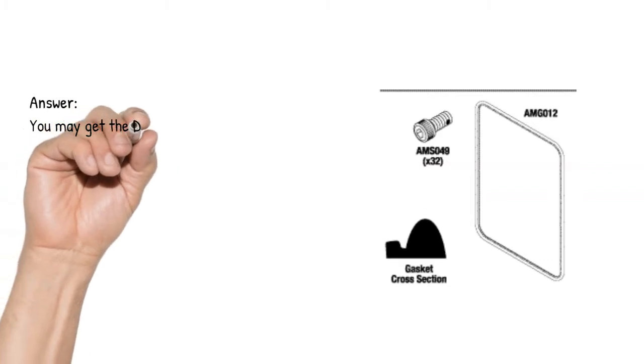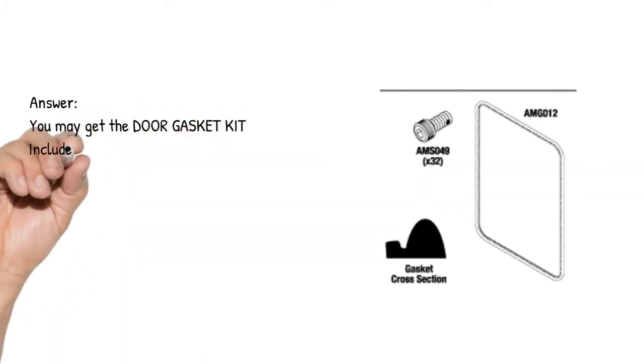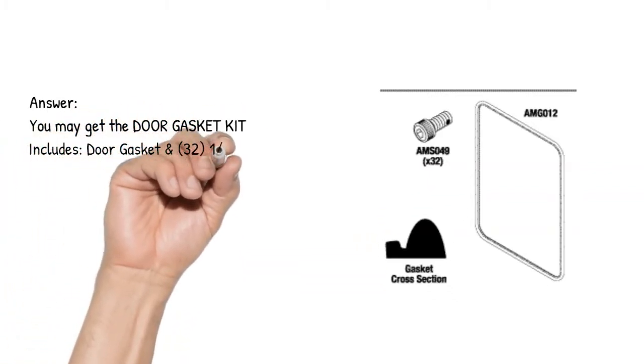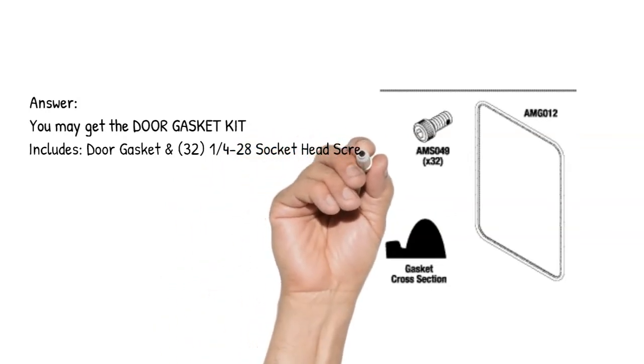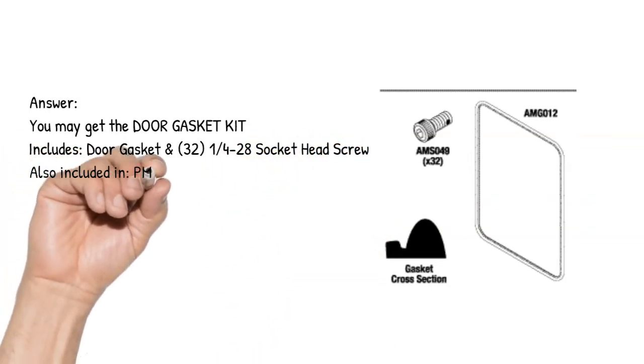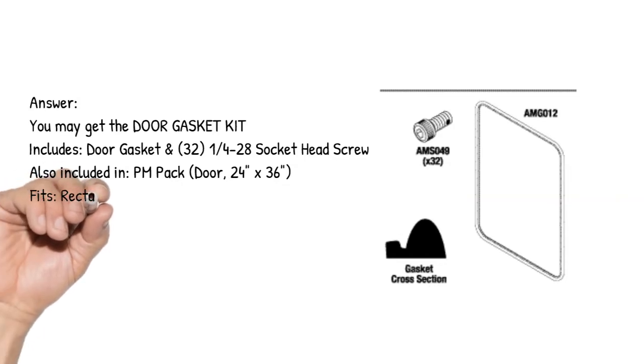You may get the door gasket kit which includes a door gasket and thirty-two 1/4-28 socket head screws. Also included in the PM Pack for a door measuring 24 inches by 36 inches.